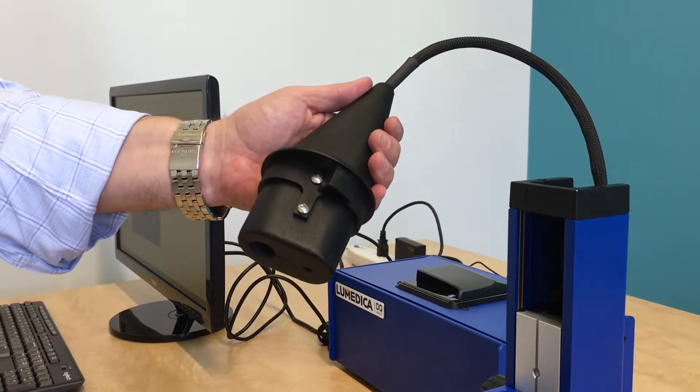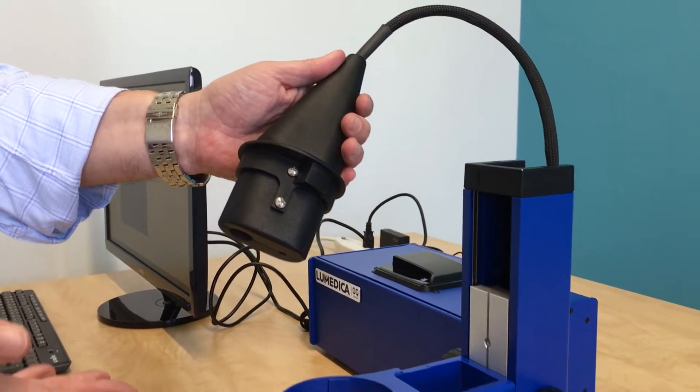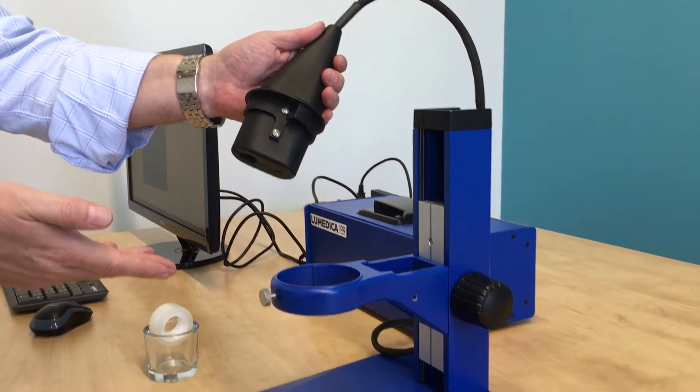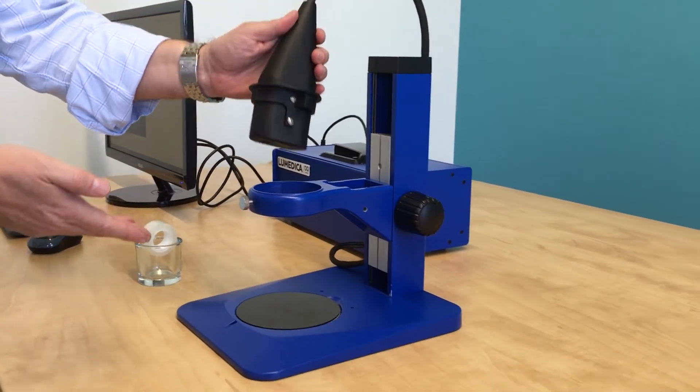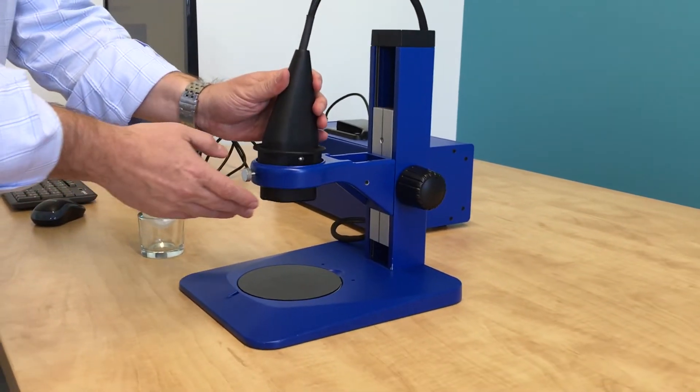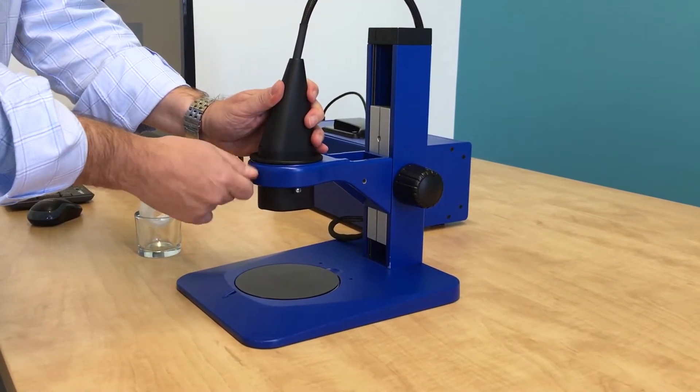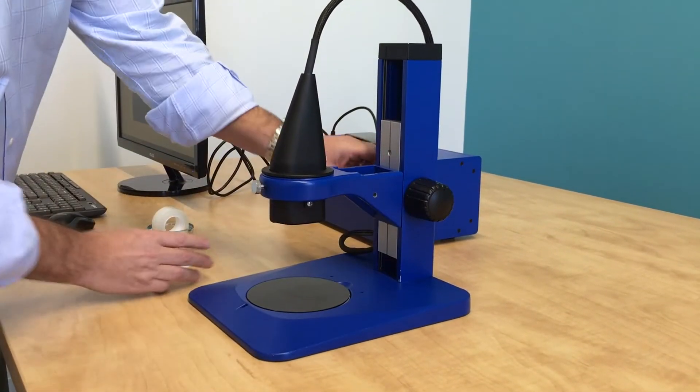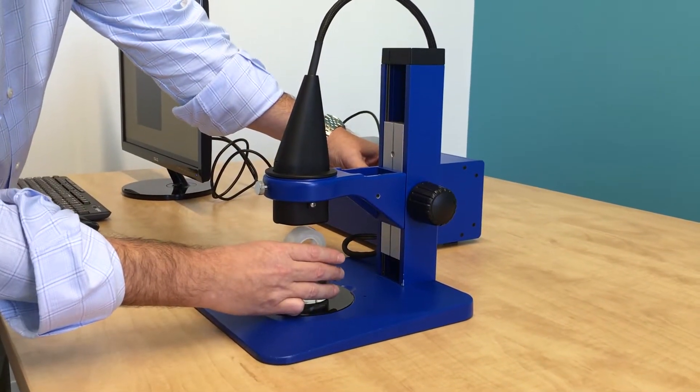It's easy to use by hand, or you can put it in this nice microscope stand that comes as part of the workstation package. You can then position it and place your sample underneath.